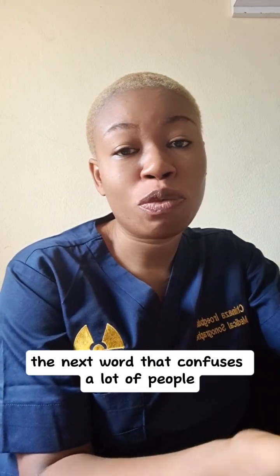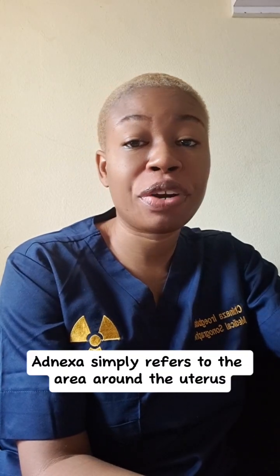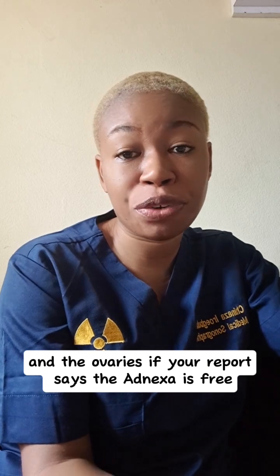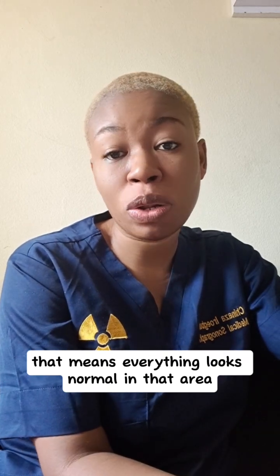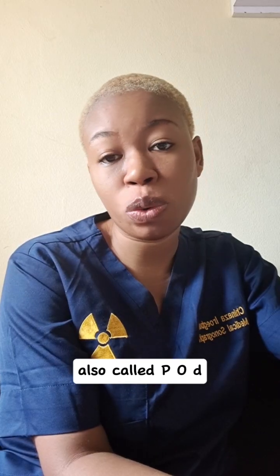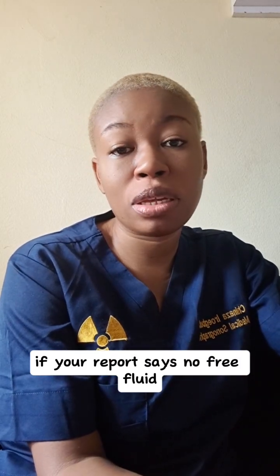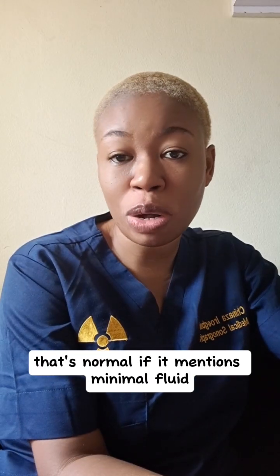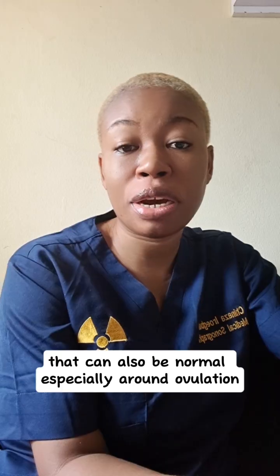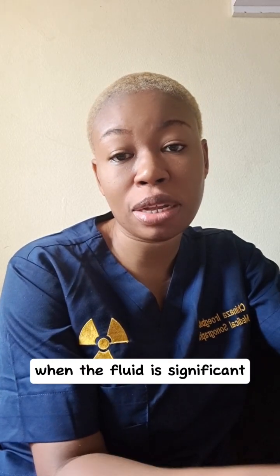The next word that confuses a lot of people is the adnexa. Adnexa simply refers to the area around the uterus and the ovaries. If your report says the adnexa is free, that means everything looks normal in that area. Then we also have the pouch of Douglas, also called POD. This is the space behind the uterus. If your report says no free fluid, that's normal. If it mentions minimal fluid, that can also be normal, especially around ovulation. It becomes a cause for concern when the fluid is significant.